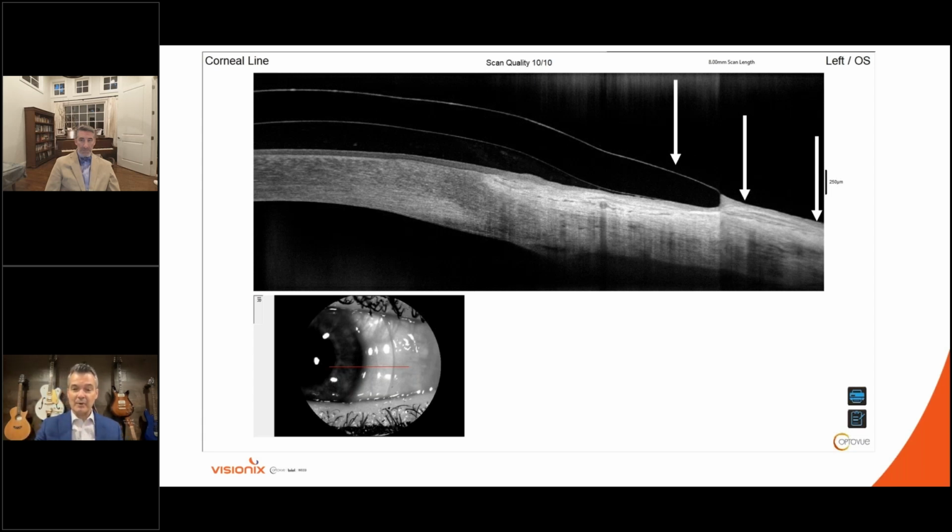So I want to pull this one arrow away. When you first look at the outside edge of this lens, it almost looks like the lens is digging into the tissue, when in actuality there's just a subtle image shift occurring that makes it look like the lens is digging into the tissue, when in fact it isn't. So be cognizant of that.